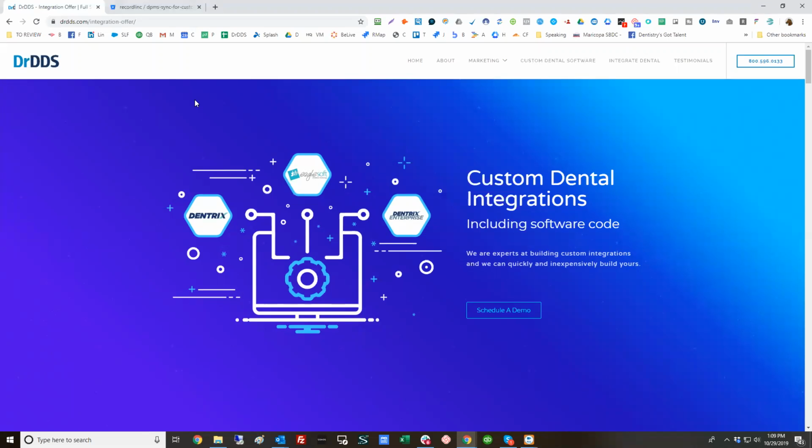For sure. In as much as we understand what you guys have, even with OpenDental, which should have been simple, we realized that OpenDental doesn't handle media in their APIs. So we knew that even if we built out a connector in the cloud to an OpenDental instance to get the patient and clinical data out, we were still going to have to build out a local Windows installation that would get the media from their system to ours.